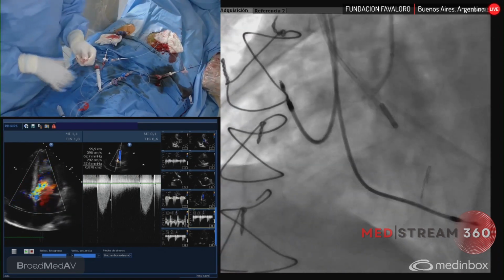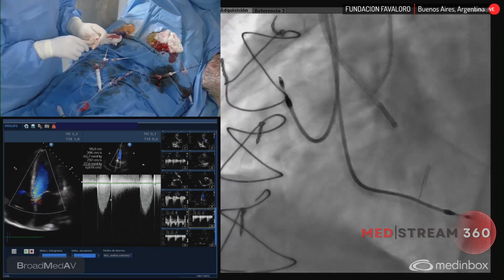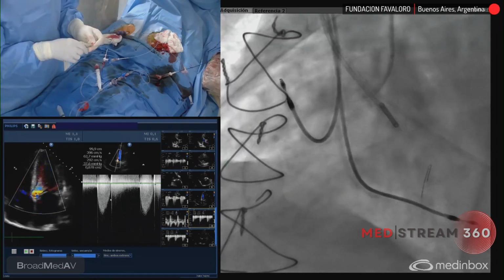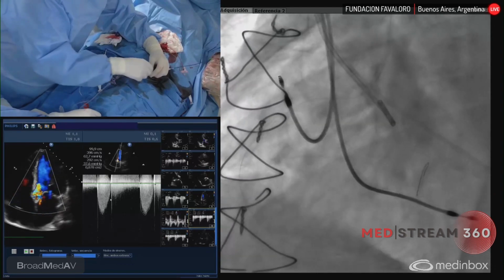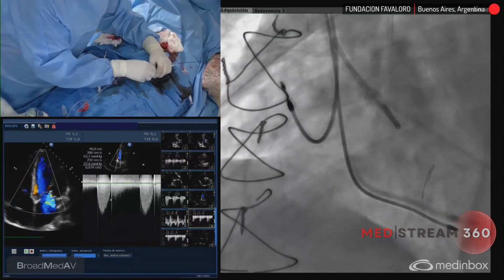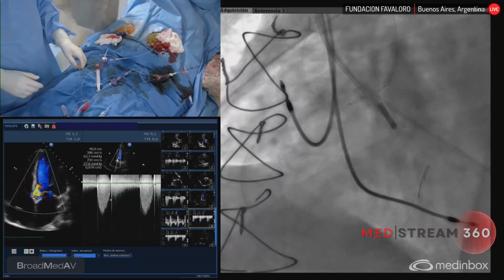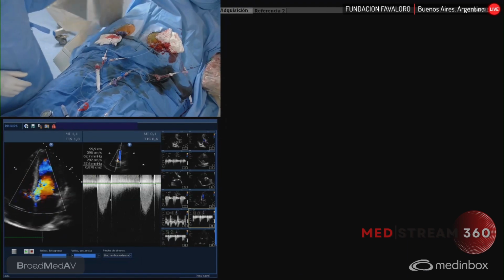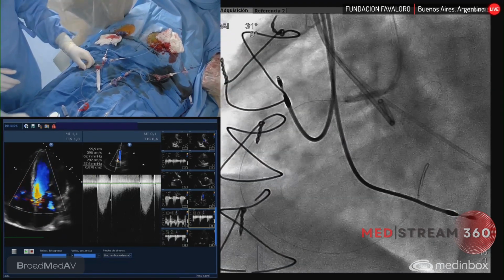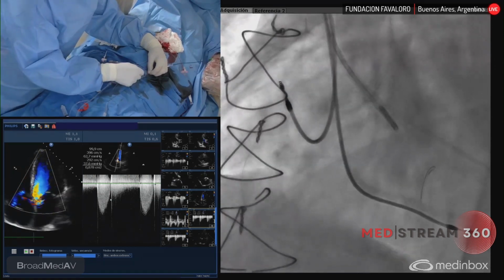Let's go with 3.0. And then I think we can deploy a 3.5 by 15, the stent. Okay, as you can see, the guiding, all the guide, and also the telescope. Let's go 10. It seems better. Okay, deflate. Let me pull and push, trying to rotate the blades.